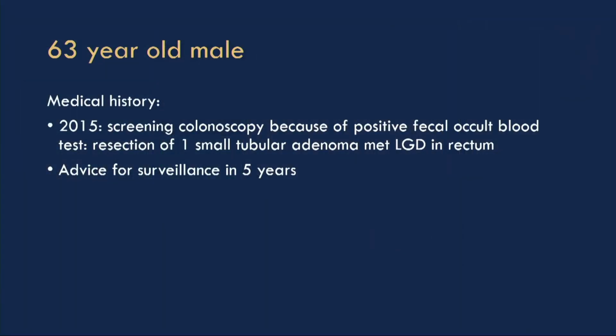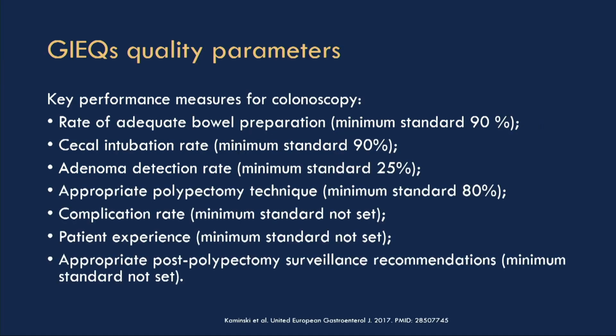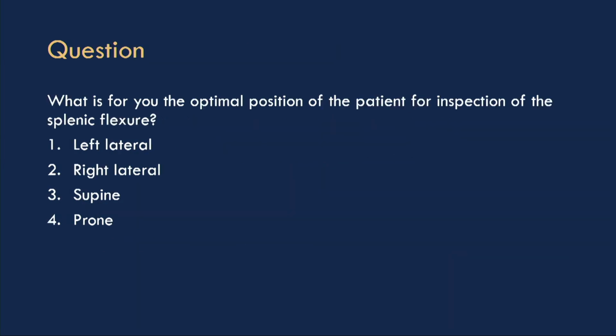So this is a 63-year-old patient who 5 years ago has had a colonoscopy with removal of a small tubular adenoma. Today we do the surveillance colonoscopy. On the next slide we have some quality parameters, and in this case as well we have a multiple choice question. On the next slide. So for you, what is the optimal position of the patient for inspection of the splenic flexure? You have the options right there.